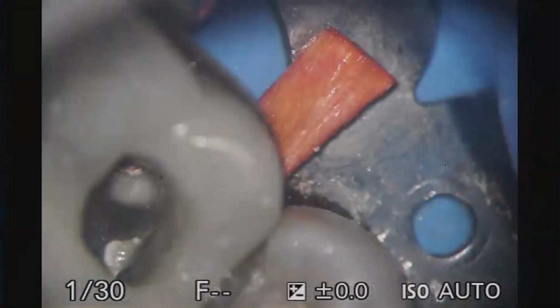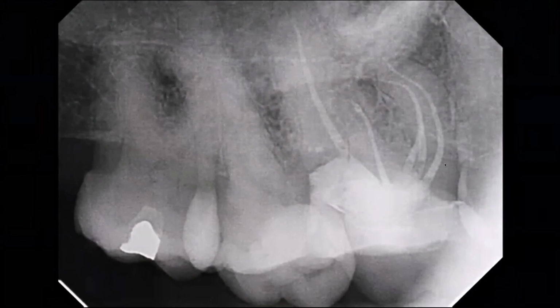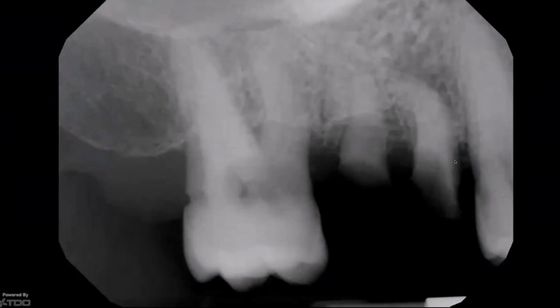And what I did was, there was a little bit of a furcation involvement on the distal aspect of the furca. I was able to pack Teflon tape and really create a seal along with a wedge and a matrix, just slipping a matrix beyond the contact to create some version of a seal from that crown. So you could see there we were able to get a margin, and at least his crown is safe for now. In these cases, no, we're not talking about tooth number three, talking about tooth number two.